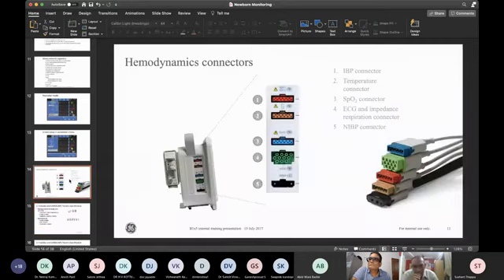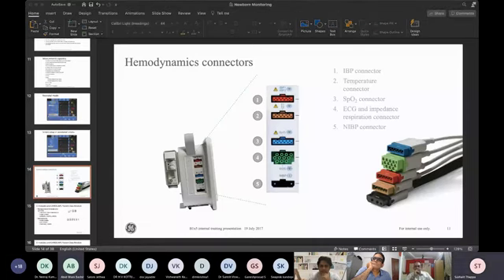So Philips uses something called Fourier artifact suppression technology, and Masimo uses something called SET technology. What is the technology used in GE SpO2? So, Sushanth, are you there? Hello. Yeah, Sushanth, go ahead. I think I disconnected. Can you repeat that, please? Okay. So Philips uses SpO2 technology called Fourier artifact suppression technology, and of course we all know Masimo uses SET technology. What technology does GE use?